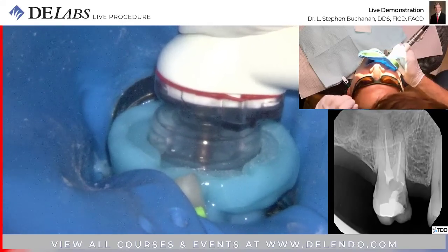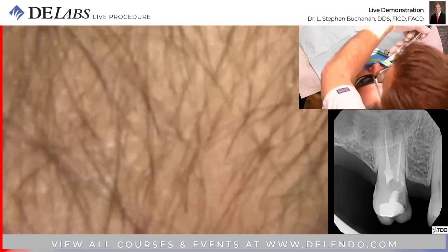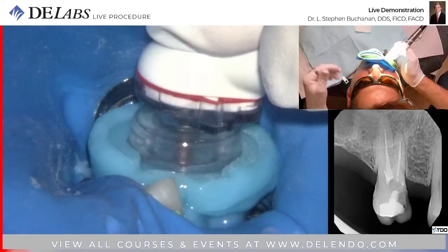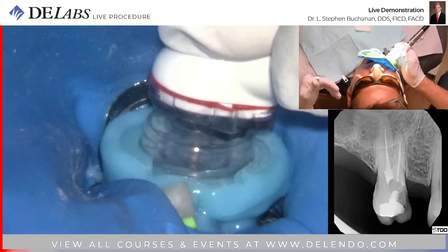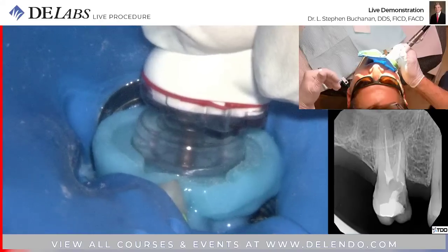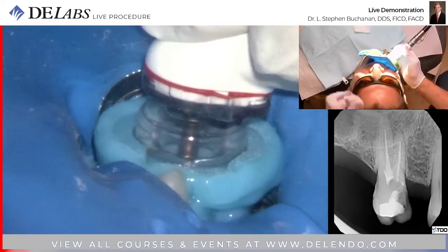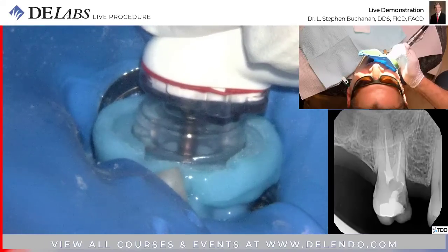If we were too aggressive at the end of the root canal in an upper molar under a sinus space, you could have a problem not with hypochlorite going into the sinus, but with air coming from the sinus into the root canal system, eliminating the negative pressure environment, and that's not what we want. That's not going to be as effective. So that little sealing cap is all filled with fluids.